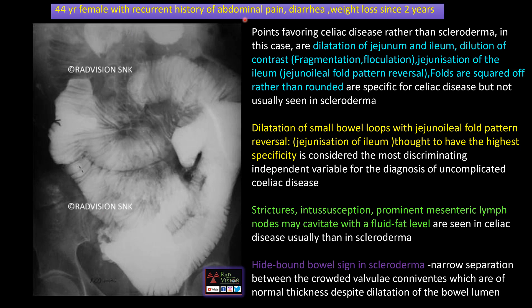Next case: a 44-year-old female with recurring history of abdominal pain, diarrhea, and weight loss since 2 years. You can see there is dilatation of both jejunal and ileal loops, dilution of contrast with fragmentation and flocculation. The valvulae conniventes are separated but are typically squared off rather than rounded, with widening and separation of valvulae conniventes. In the ileum, you can see jejunization, called the jejuno-ileal fold reversal pattern. Dilatation of small bowel loops, dilution of contrast, widely separated valvulae conniventes, and jejunization of the ileum are classical imaging features of celiac disease.